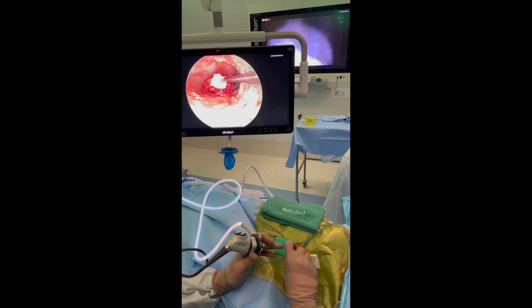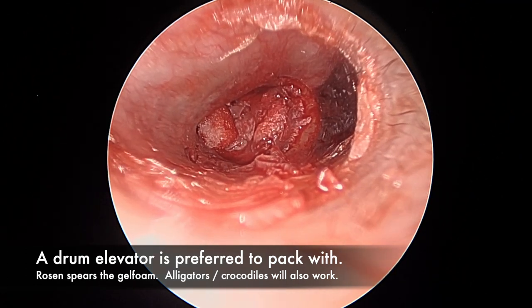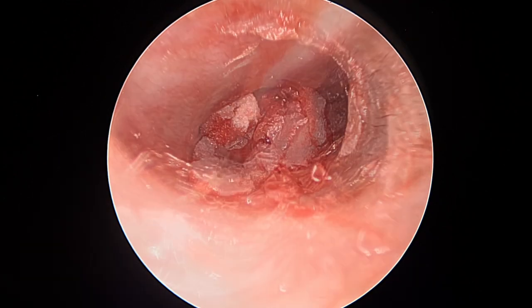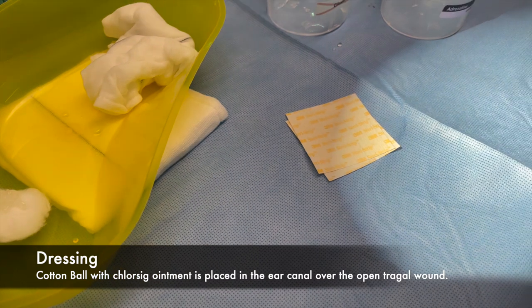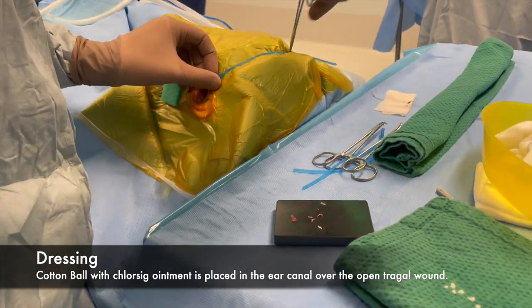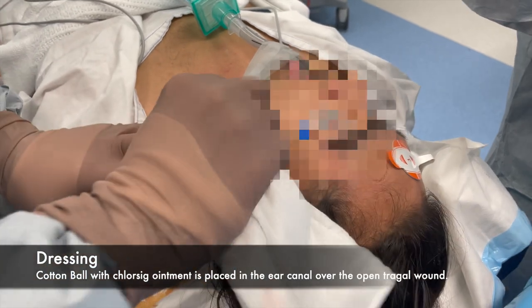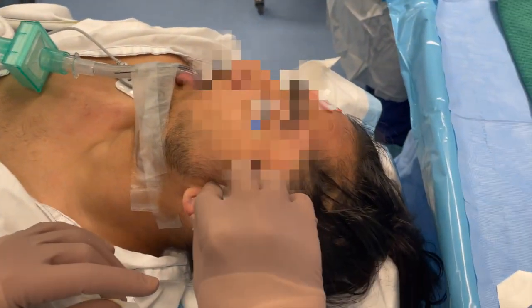Using a drum elevator or Gimmick — cups, alligators, or crocodiles can all be used. Packing reasonably firmly in the anterior tympanomeatal angle and relatively gently over the incision site, just up to the incision line. A cotton ball with chloramphenicol ointment and steristrips are used to close the ear canal. The chloramphenicol is placed over the raw tragal wound — patients are told to change this daily for 3 to 5 days until it stops bleeding, then use a cotton ball with chloramphenicol or Vaseline for 3 to 4 weeks until the first postoperative appointment. Thanks very much for watching this long-form video.